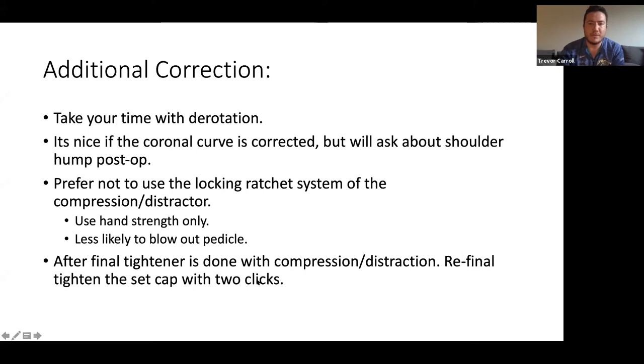And then after you do the compression distraction or the derotating, you tighten it again, because of the amount of torque when you're doing that, it'll still tighten.